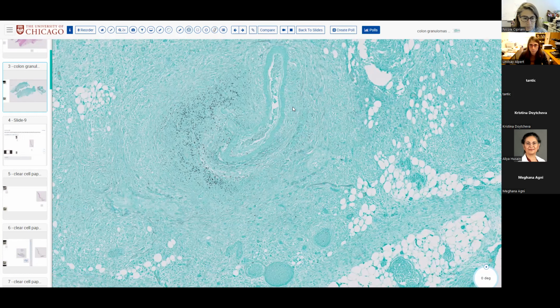Was there any clinical test, like an antigen test, that was done that might have pointed towards this diagnosis? After we got the resection, they did do a urine antigen test, and it was positive. But initially, they didn't know that this was the diagnosis. So they used that to confirm this was histoplasma, because we called it consistent with histoplasma, rather than the other way around. Clinically, they didn't know what it was.